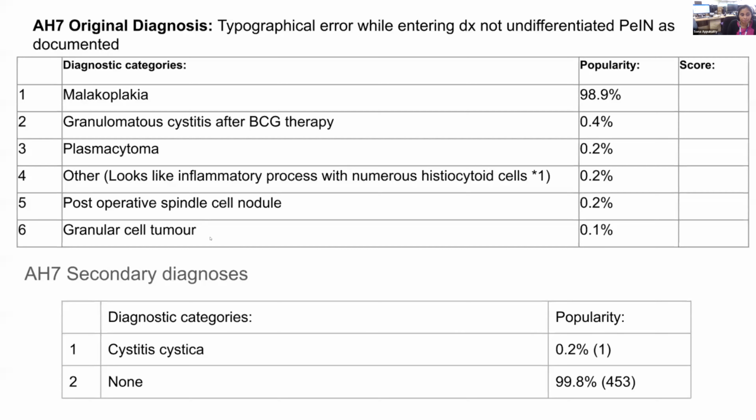Granular cell tumor. Can see why people thought it's granular cell tumor, but they don't look properly like granular cell tumor. They had more inflammation. Normally granular cell tumors are ovoid or spindle with fibrocollagenous bands, less inflammation, and of course Michaelis-Gutmann bodies help to differentiate.